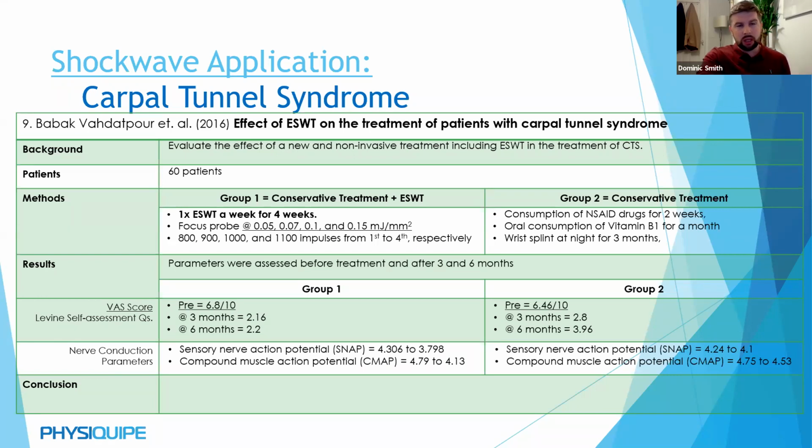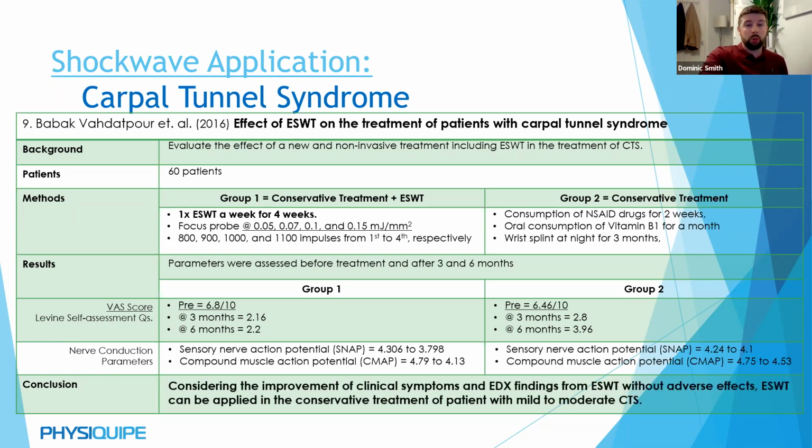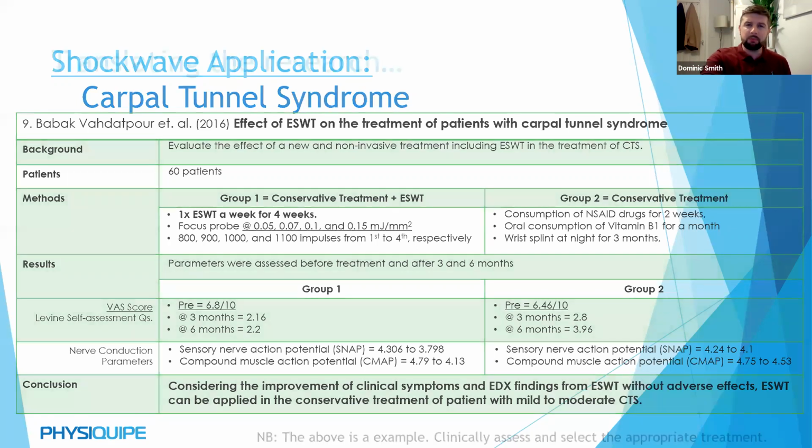So looking at results, looking at nerve conduction parameters, and also the VAS and Levine self-assessment questions as well. We see good results in the Shockwave treatment, and considering the improvement of clinical symptoms from Shockwave without any adverse effects, they've concluded that Shockwave can be applied in conservative treatment for mild to moderate carpal tunnel syndrome. So quite interesting results. I find this quite an interesting area because it's more of a nerve rather than our typical musculoskeletal soft tissue injury. So I do find that's quite an interesting area from that perspective.